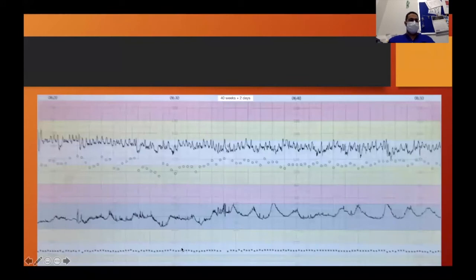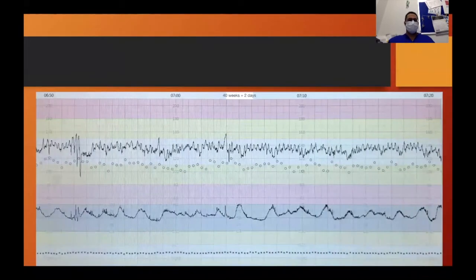Sorry, I know that the change within here. So you can also see how wavy the trace on the Stan monitor is. I'm not going to go into too much detail there, but if this becomes more wavy, we can start acting a little bit sooner, even if it doesn't alarm. Too far at the moment, let's not. But Stan is stable and the baby is actually improving with this. Baby's baseline is coming slightly back down.